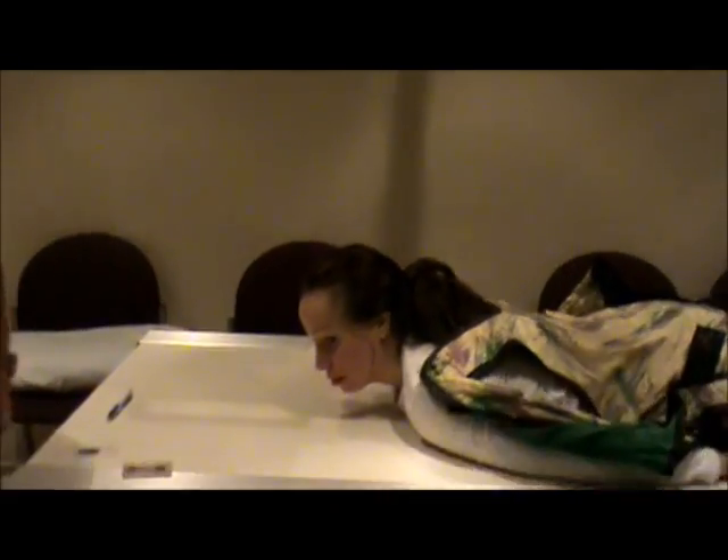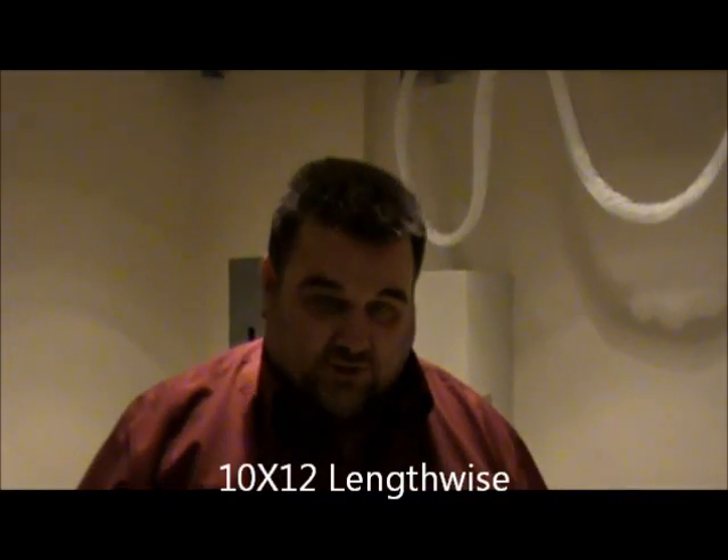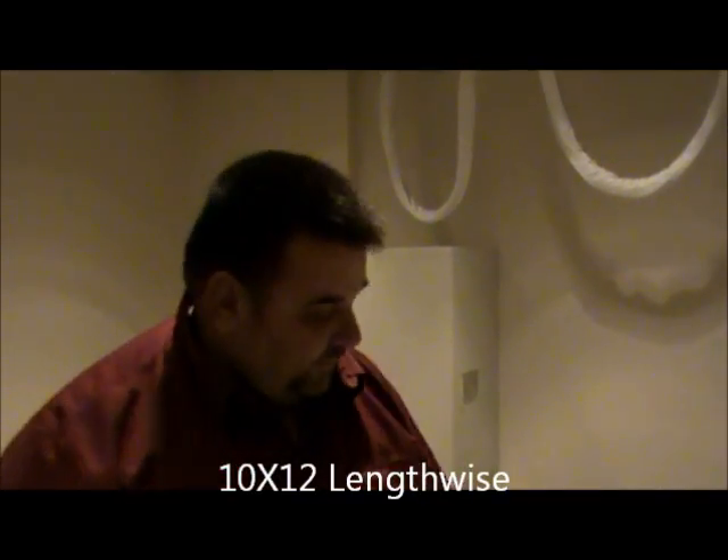We're going to use a 10 by 12 lengthwise. The technique will be 77 kV, center cell, for the Waters view.